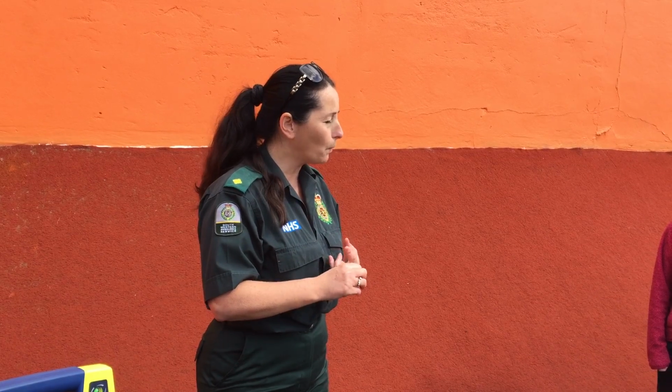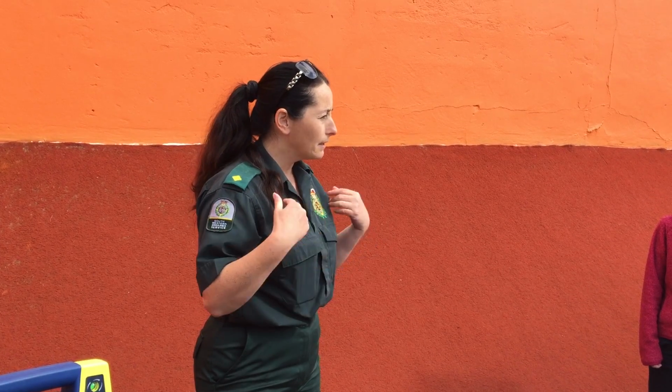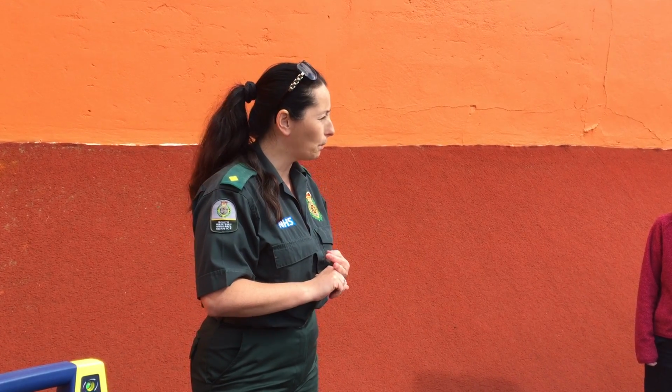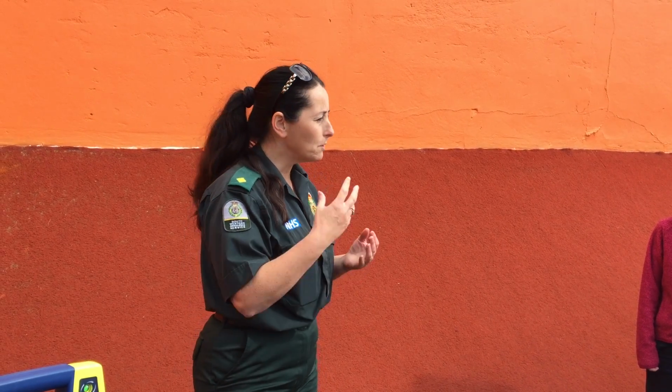If there are 2 people on the floor, you might start questioning why there are 2 people, but you're going to again risk assess it and see if it's safe to approach. If there are 3 or more people on that floor, I'm going to say to you, do not go in. Go back outside, make a quick phone call to the operator, to 999, and they will send the appropriate resource. It could be gases, it could be chemicals, it could be anything in there. So make sure it's safe for you to approach. Then we're going to move on.